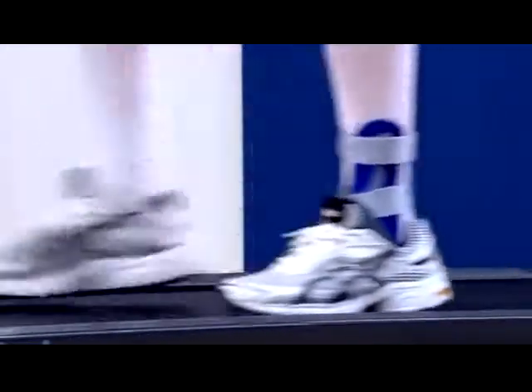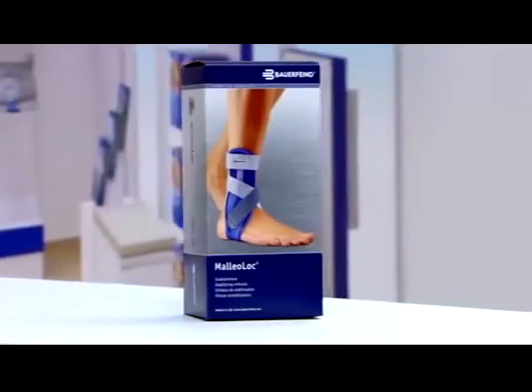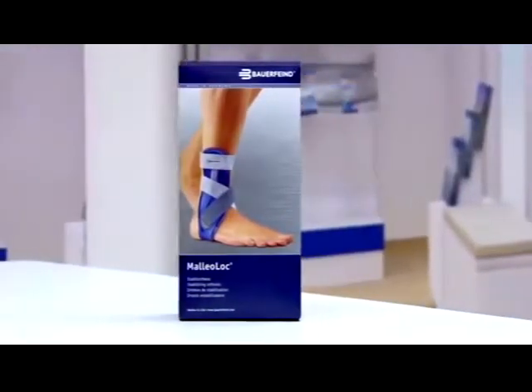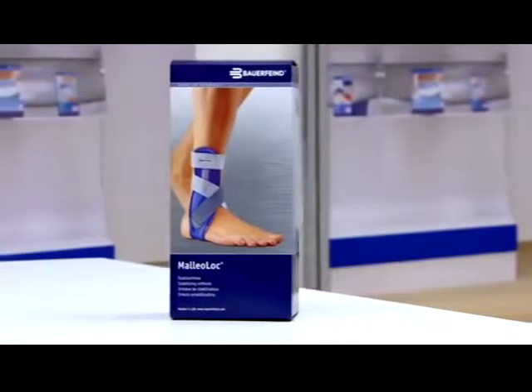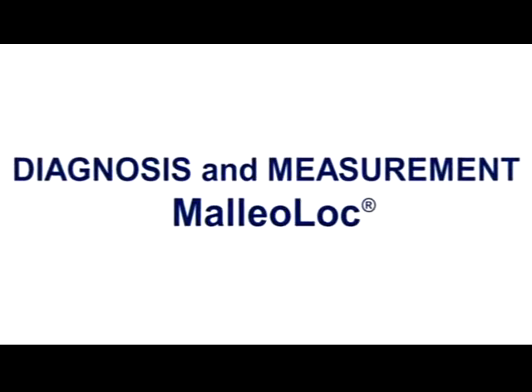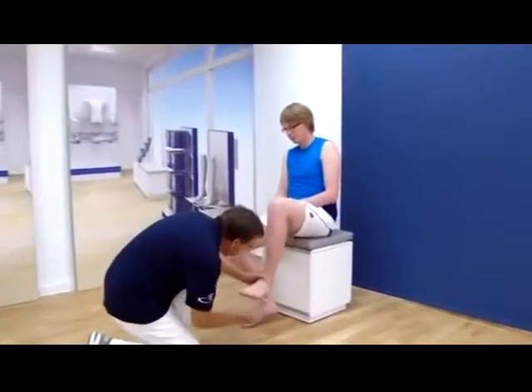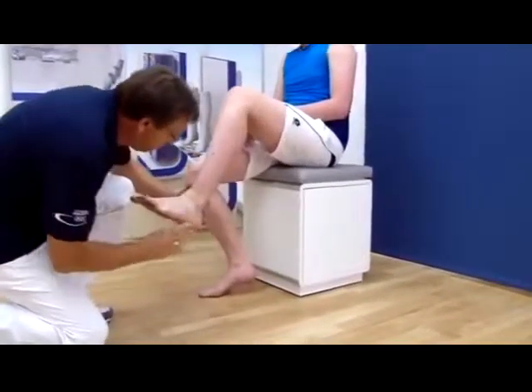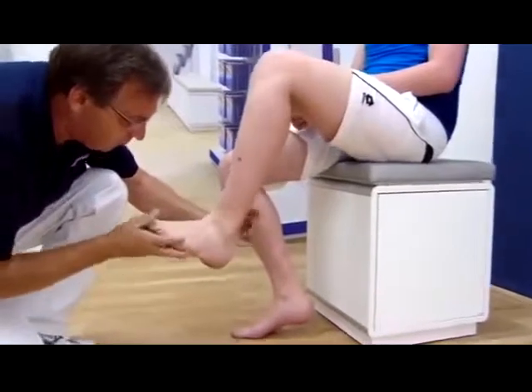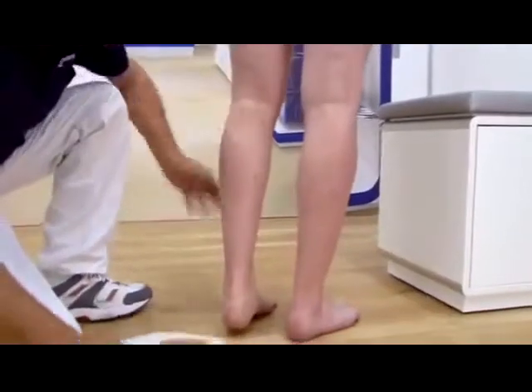Malleolock is also indicated in cases of chronic ligament insufficiency. The construction of the Malleolock counteracts the forward movement of the talus and ensures that all affected ligament structures in the upper ankle joint are able to heal. Before measurements are carried out, the ankle in need of treatment is checked for any external injuries and skin defects.